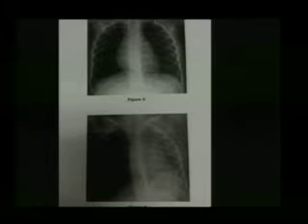Look at this. The initial chest X-ray, this is more lucent. Normally, this diaphragm is a little bit higher than this one. This one's a little bit lower. This is more lucent than this lung. Here, when this side got real big, this side got normal. If you have a ball valve mechanism, if you're normal, like right now if I did a decubitus on me, the side that's on the lower part, the decubitus part, is smaller, and the upper one gets bigger. Then you flip them and that one gets smaller and that one gets bigger. In this case, with the foreign body on the right side up, it got big. But when they switched them, the right side doesn't get smaller. This is on the dependent portion. This should have got smaller. So the foreign body is in the right main stem bronchus. So that is absolutely correct.